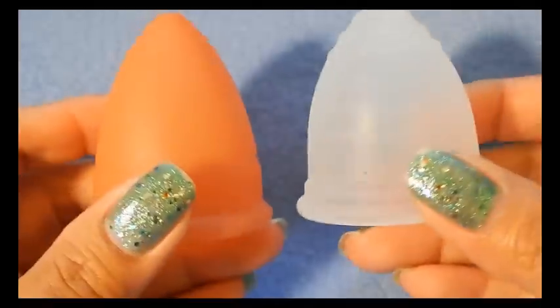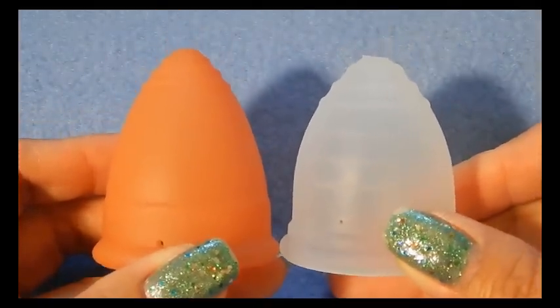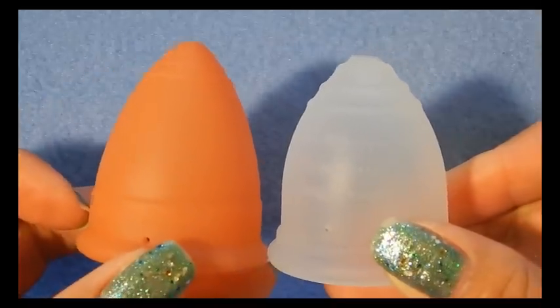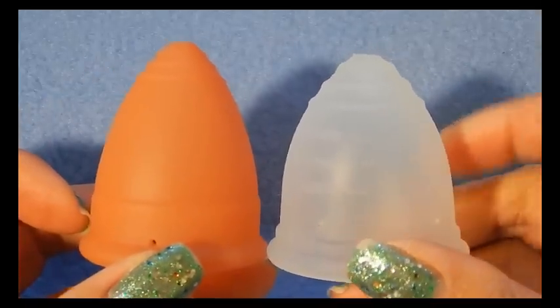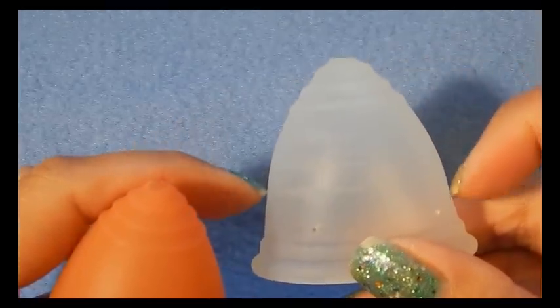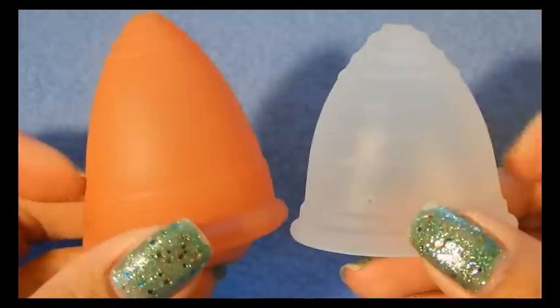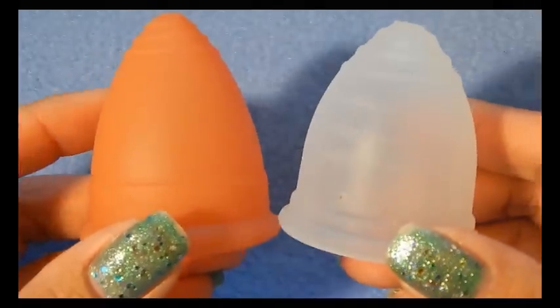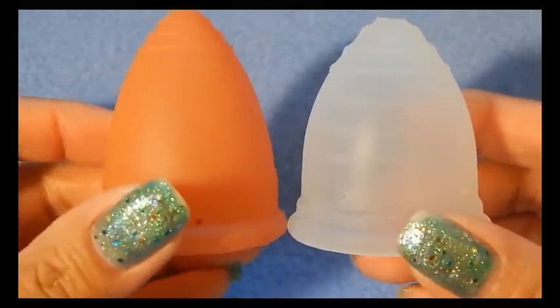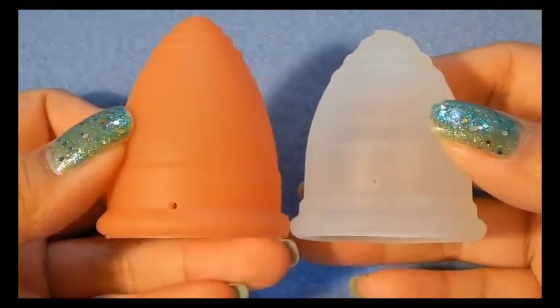These two cups are different shapes. The Ruby cup is more of a bell-shaped cup and the Lunette cup is more of a V-shaped cup. You can see that the Ruby cup bows out just a bit more than the Lunette does, and the bottom of the Ruby cup flares out just a bit.